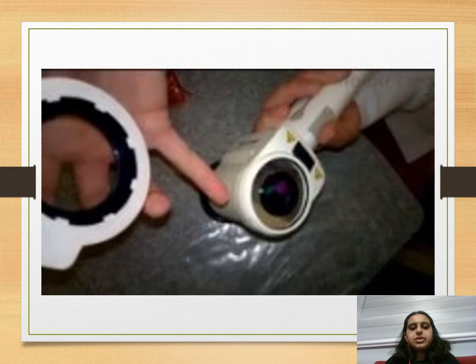This cap is actually very easy to use because it clicks on really well. It has those grooves on there, which allow us to clip it on easily. You can see that there, and the blue side is outside. Those are good markers: the blue on that side and the blue on this side. Then it clicks on there, so that's pretty good. That's the barrier I was talking about. The barrier has these two little holes coming out. The whole point is that the middle part covers the middle, and then you have the two camera sides there.